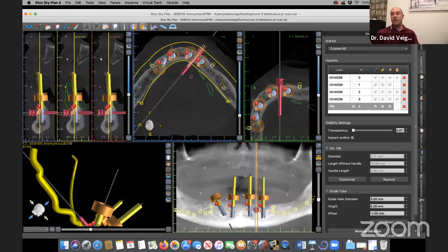That can also correspond with metal ceramic restorations. Usually the metal sits underneath the porcelain, and the porcelain cusp tips or the incisal edges come up really clear in the DICOM data. Some scanners are better at reducing scatter. They have an automatic scatter reduction algorithm within them. I tend to find that the newer scanners are better than the older scanners at reducing scatter, but there's no physical way that you can actually do that. It's just what your scanner is doing, how it's picking this stuff up, and the algorithm it has in it to reduce the scatter for you.